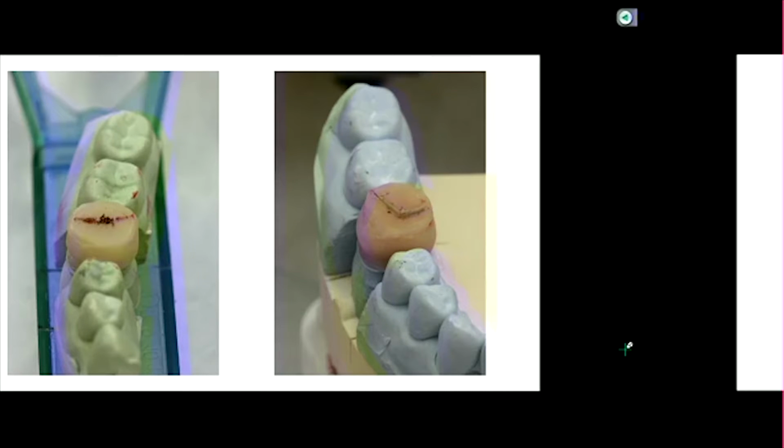So that's one of the disadvantages of using the triple tray, is that we are no longer moving in an anatomically representative motion, but rather we're just picking an arbitrary hinge point and then rotating around that.